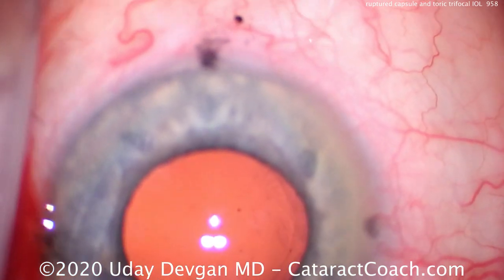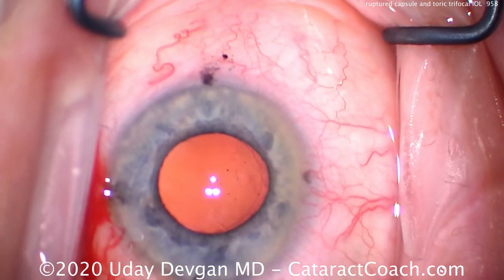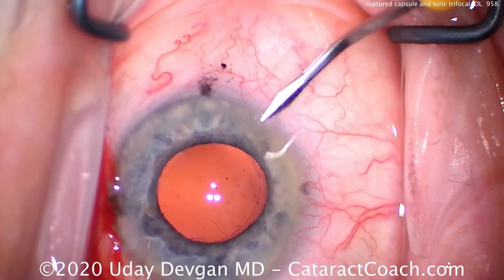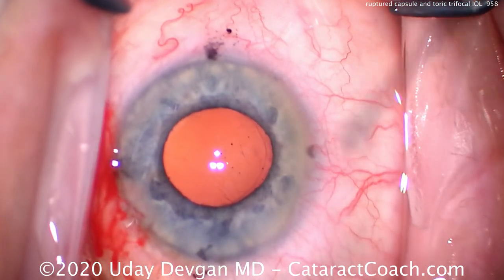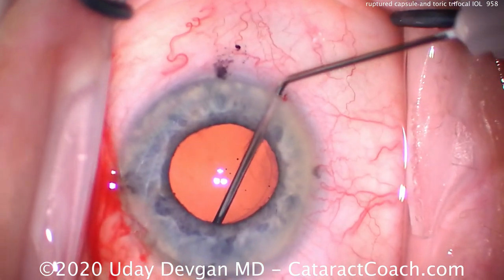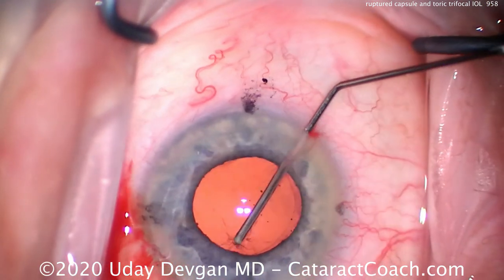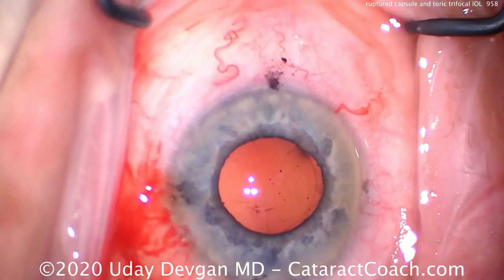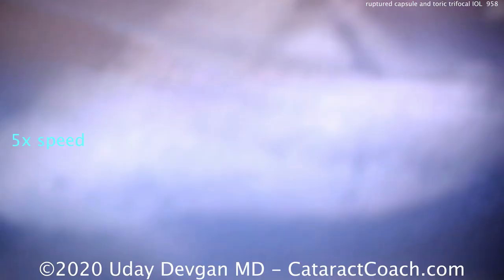There's our hole — still small and not in the center. Let's go ahead and put our lens in. This lens is a trifocal toric lens and the difficulty of course is having to manipulate that toric lens. Making another paracentesis incision here — always feel free to make another one if you need to — to access that last bit of subincisional cortex. A little aspiration just manually using a 3cc syringe with a 27-gauge blunt cannula. Now there's absolutely no cortex left. Adding a little more viscoelastic to make sure the eye stays inflated.